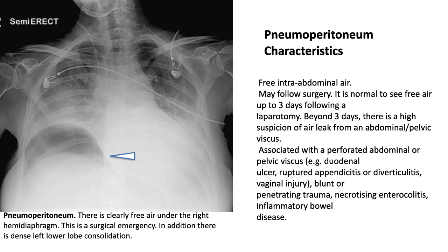Now let's talk about another disease: pneumoperitoneum, another important disease in the abdomen. Remember there are a lot of perforations, also perforation from typhoid infection here in Ghana. So pneumoperitoneum is very common. For all these patients with this pain, you have to request an X-ray, but not an abdominal X-ray. You have to request a chest X-ray to diagnose pneumoperitoneum.